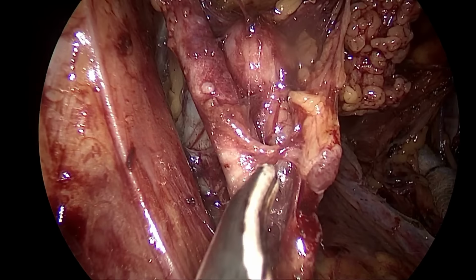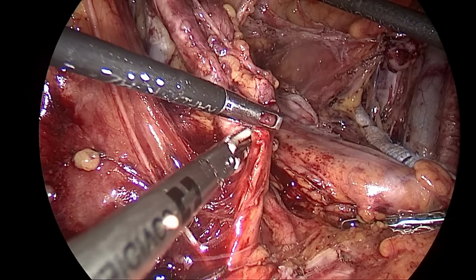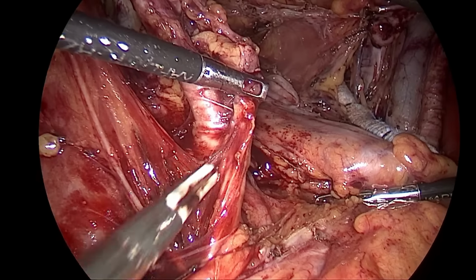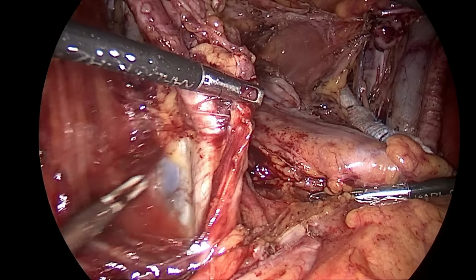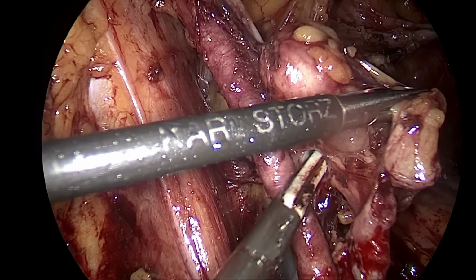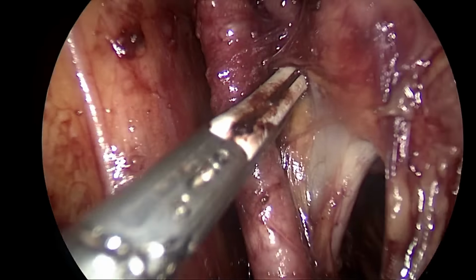So I am trying to skeletonize the nodal tissue from the vessels. Proper traction and counter traction are very helpful to get the right plane. But in this case we prepare for any inadvertent vascular injury and prepare the vascular set if needed at all. That's the vein. So the node is being separated from the external iliac artery.